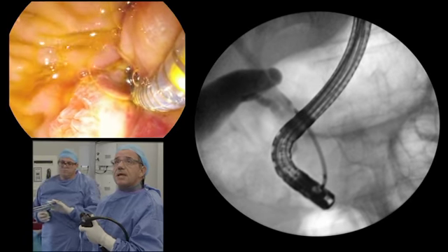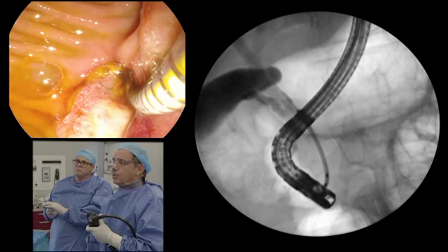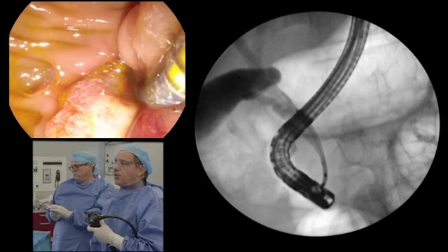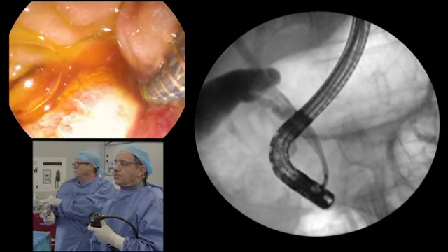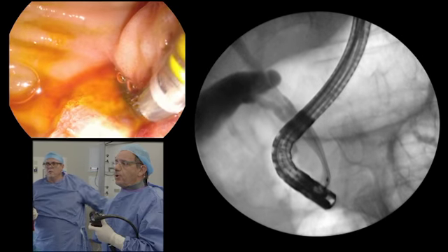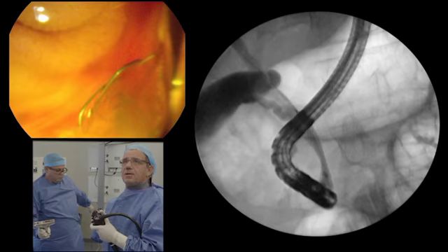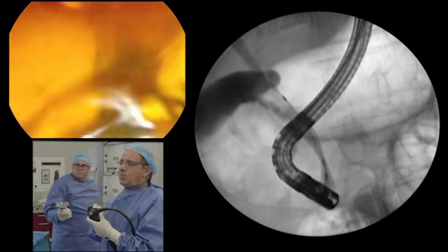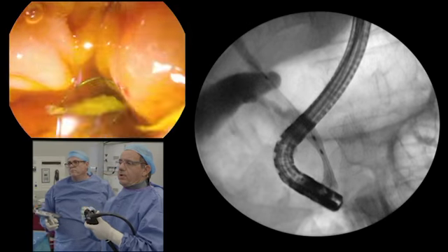You can start to open, not too long, not too short. Okay, you see the yellow marker, which is the lower part of the stent. Open, open. Completely open. Okay. X-ray. Okay, this is perfect. This is the perfect position of the stent. You see a lot of bile is coming. Okay, now I remove everything.